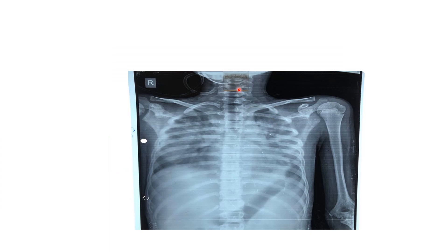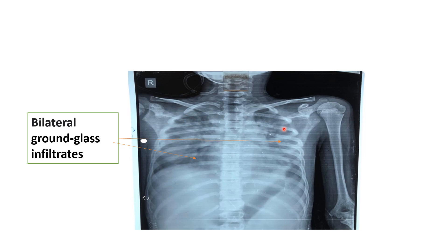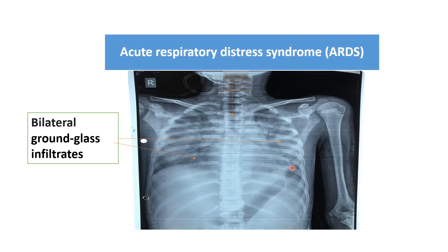In this x-ray, the trachea is in the central position and bilateral lung field opacity is present. This child was around 8 to 10 years old and had bilateral lung field opacity with air bronchogram — bilateral ground glass infiltration present on x-ray. This child was having acute respiratory distress syndrome (ARDS) and was suffering from viral infection.